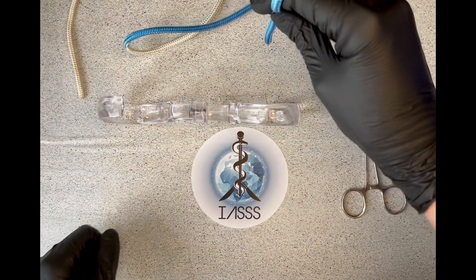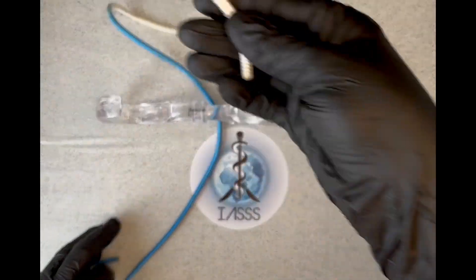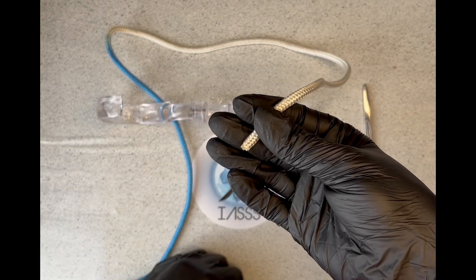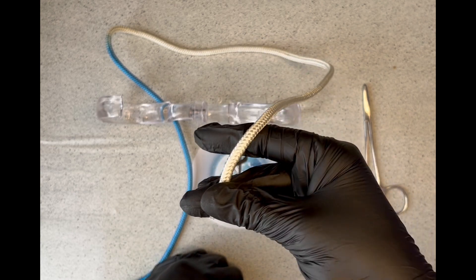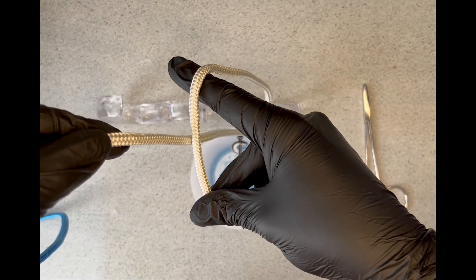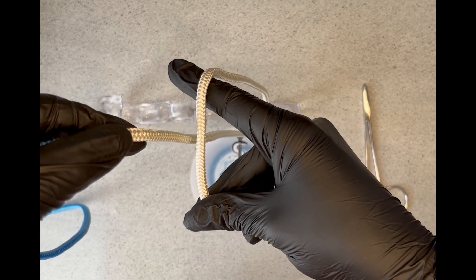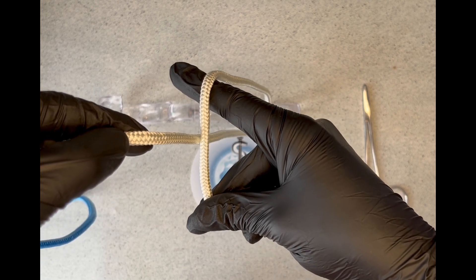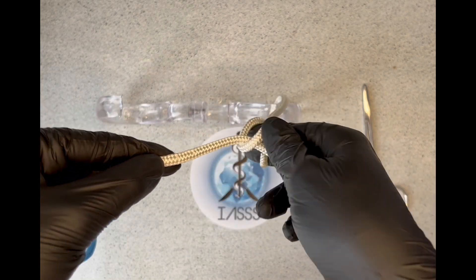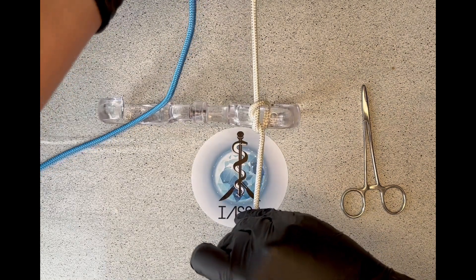You're going to suture towards yourself, so place your suture through the tissue and pull it towards yourself. Hold the free end of your suture material in your right hand between your middle finger and your thumb and extend your index finger out. Bring your suture material up into what looks like a little four — some people call this the overhand four or the extended index procedure. Take your index finger, wrap it around this end and loop it through, pulling it towards yourself. That creates the first loop of your reef knot.